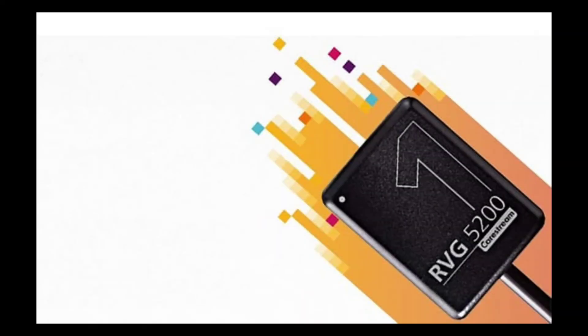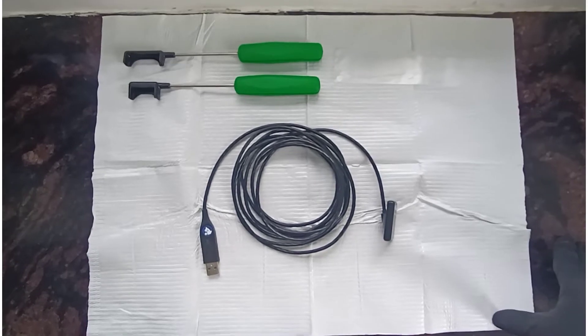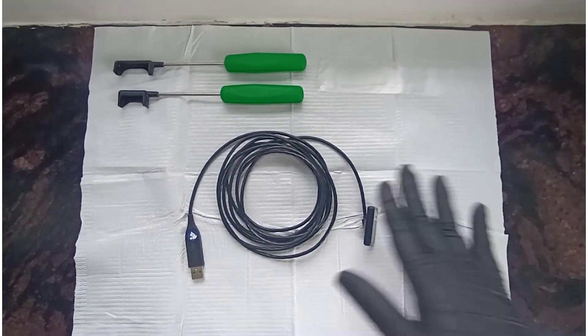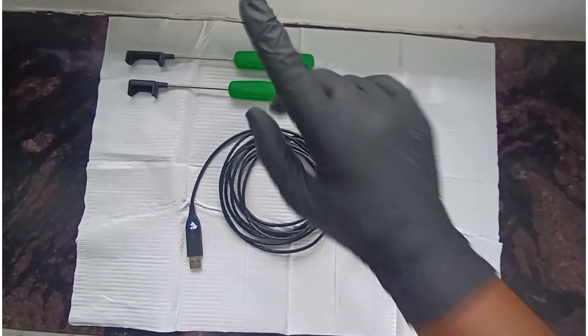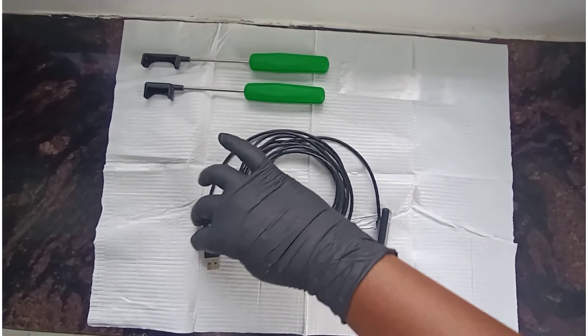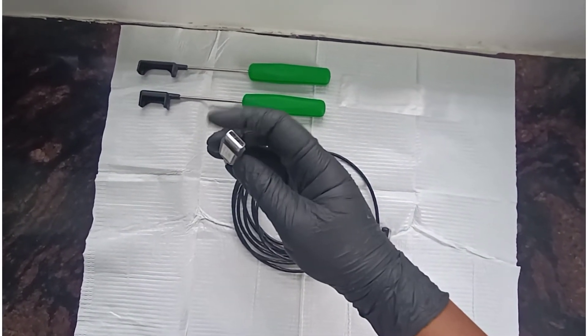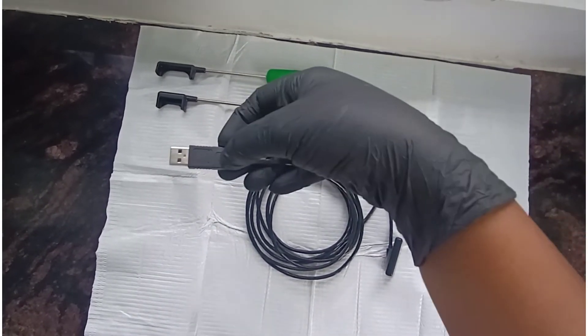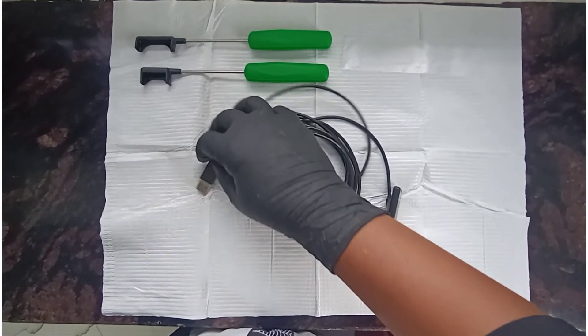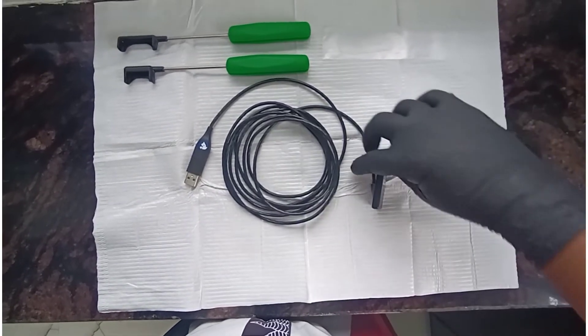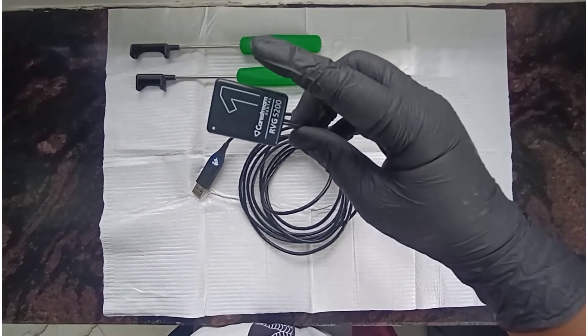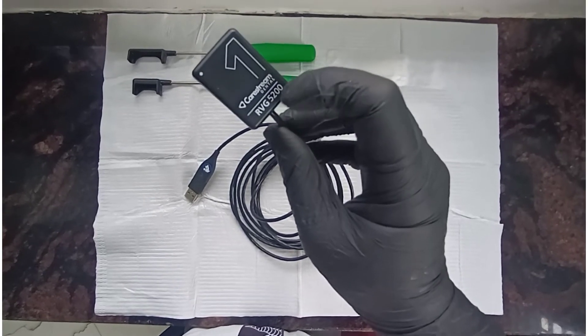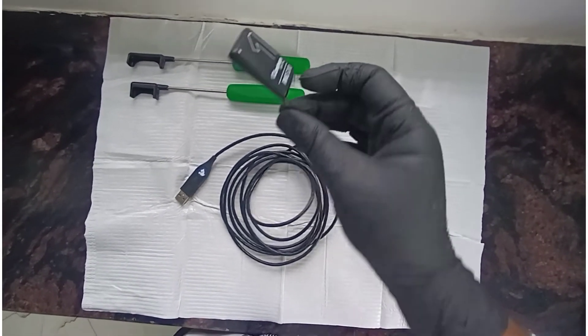The main component is the RVG sensor, which comes with a USB cable attached to the computer. You will also get a steady wire. The RVG sensor I'm showing you is a Kodak RVG 5200, which is a mini head one.